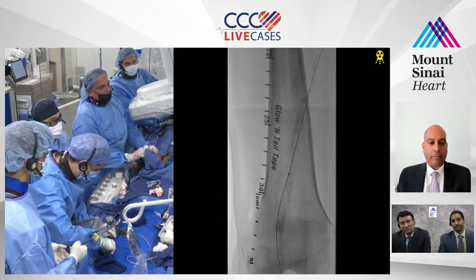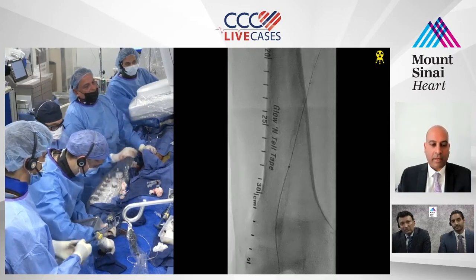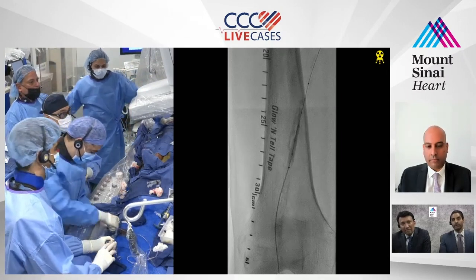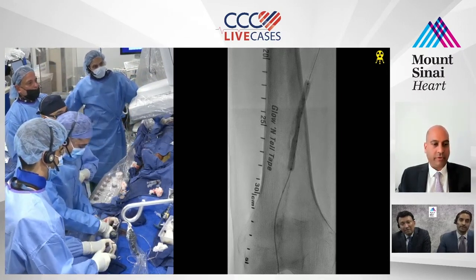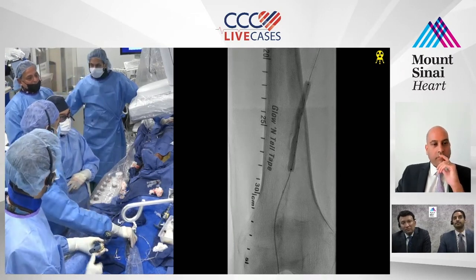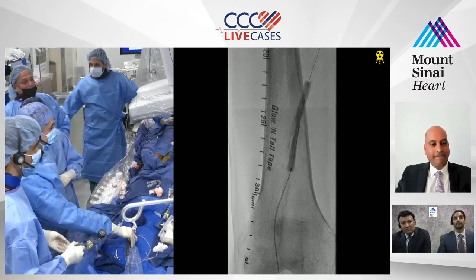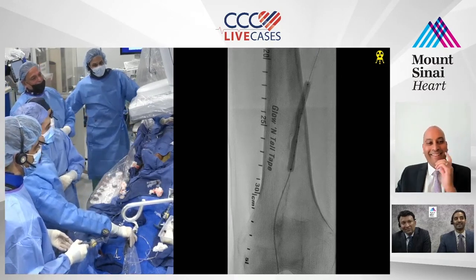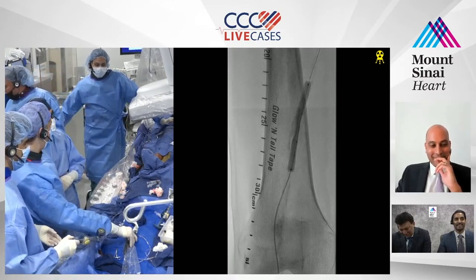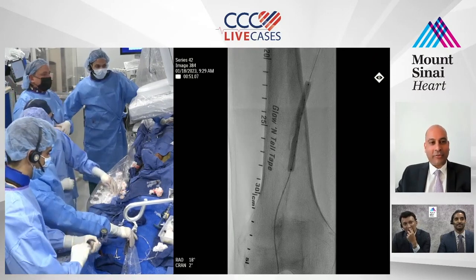I think with calcium, it also depends if you want to stratify it, right? Are you dealing with mild calcium, moderate calcium, severe calcium? Yeah. And then also whether you're luminal or subintimal, it definitely changes the algorithm there. After doing a lot of these for over 20 years now, I can tell you that for severe calcium, my answer is Dr. Rao. Dr. Rao will do an endarterectomy, and we'll do a nice bypass, and we'll get a patency rate at 5 years of 90%. I'm happy with that. Yeah, that's true. Scalpel still works. We do all this stuff, and it does.